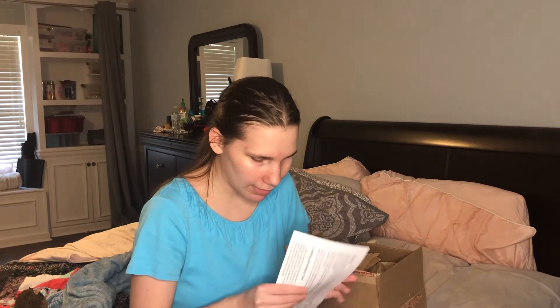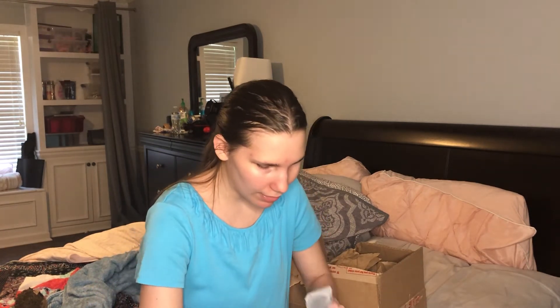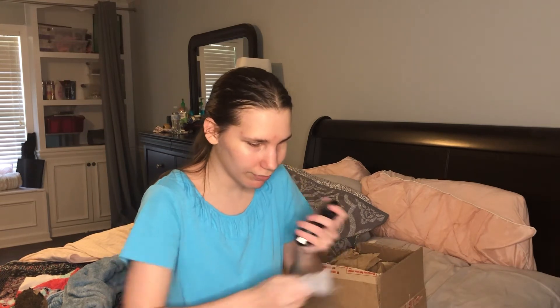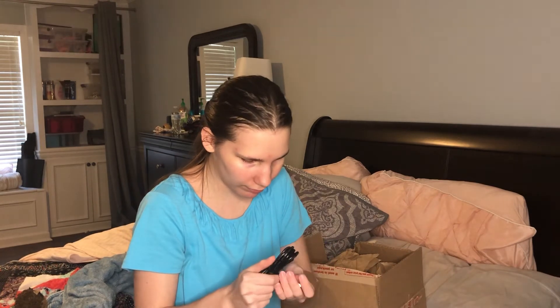There's some print instructions — don't need to look at that. And this is the charger. I'm going to save the Braille display for last because I'm excited about it. I'm going to open this charger first. I wonder if you have to charge it before you use it, or if you can just use it out of the box.